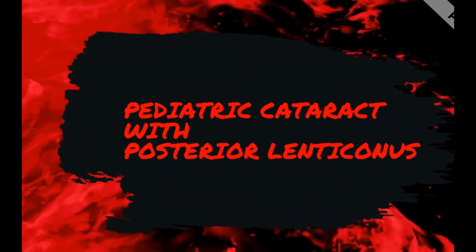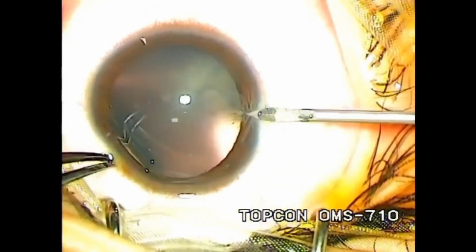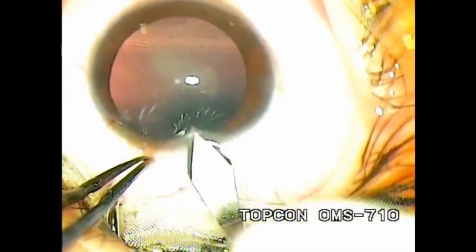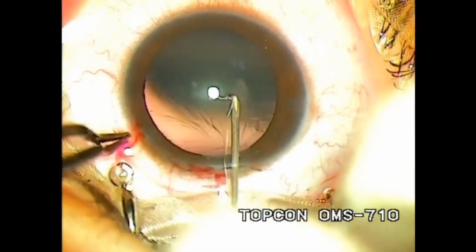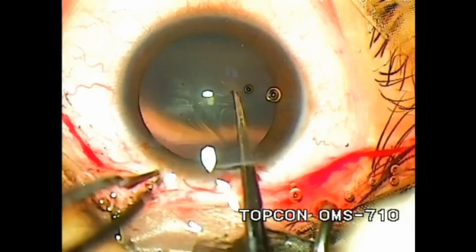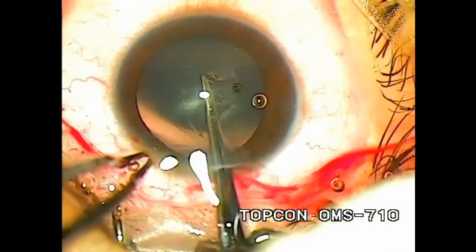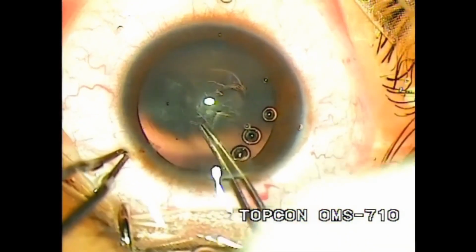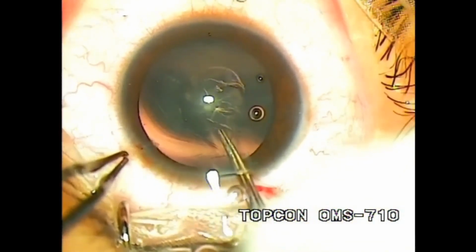Now we present to you a case of an 8-year-old male child who had a posterior lenticonus with posterior capsular dehiscence. The patient had a visual acuity of 6/9 in the affected eye, but needs early surgical intervention because 8 years is a critical age for developing amblyopia. The basic objective of performing cataract surgery in this child is to clear the visual axis.